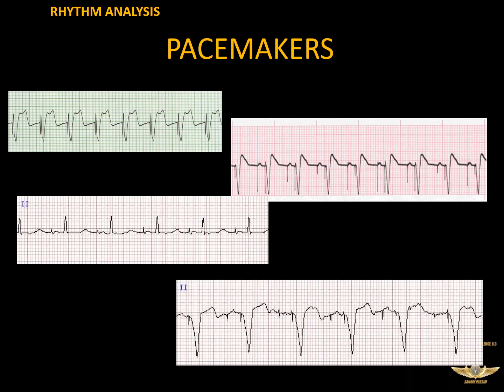Just a real quick word about pacemakers. We could literally spend a semester talking about nothing but pacemakers. Now, relax, we're not going to do that. But there are so many different varieties of pacemaker. The pacemakers do different things. They are put in different chambers of the heart. They activate in different ways. They may be demand. They may be fixed. They can just be all different kinds of things.